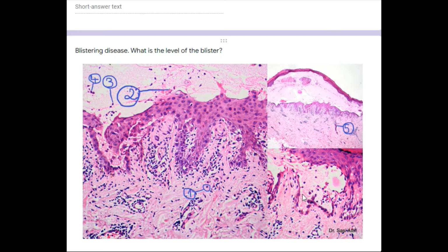Now there are two types of festooning if you want to read about it. Festooning can be decorated or undecorated. Undecorated festooning applies to subepidermal blistering diseases like porphyria cutanea tarda typically, where there is no tombstoning. But when there is a decoration of these acantholytic keratinocytes on top of these festooned dermal papillae, these are called decorated festoons. Okay, but this is still festooning. This is festooning of dermal papillae for sure.